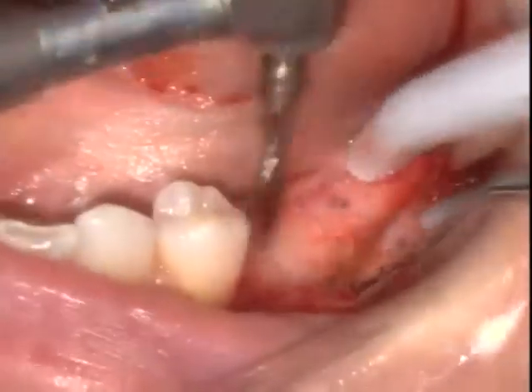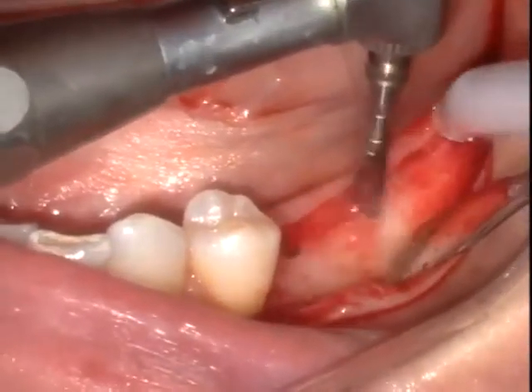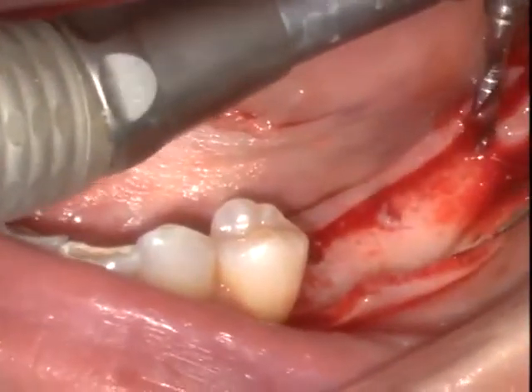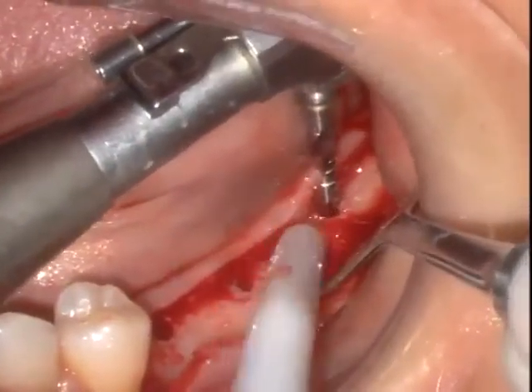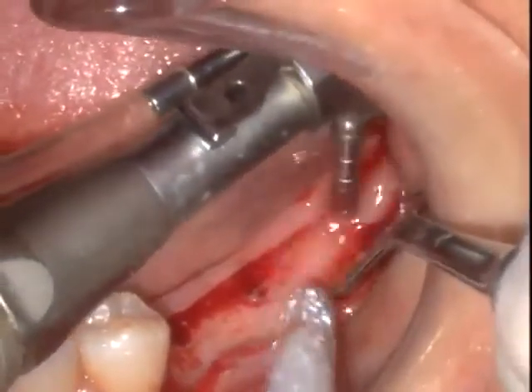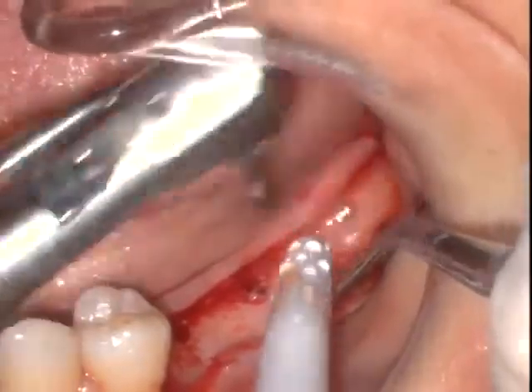The 2 millimeter twist drills are then placed at 10 millimeters in the second bicuspid region, 8.5 millimeters in depth in the first and second molar region. And we recall from the cone beam image that we understood that we were going to have slight facial dehiscences of about 1.5 to 2 millimeters on the distal 2 implants. And we planned bone grafting in those areas as part of our treatment plan.